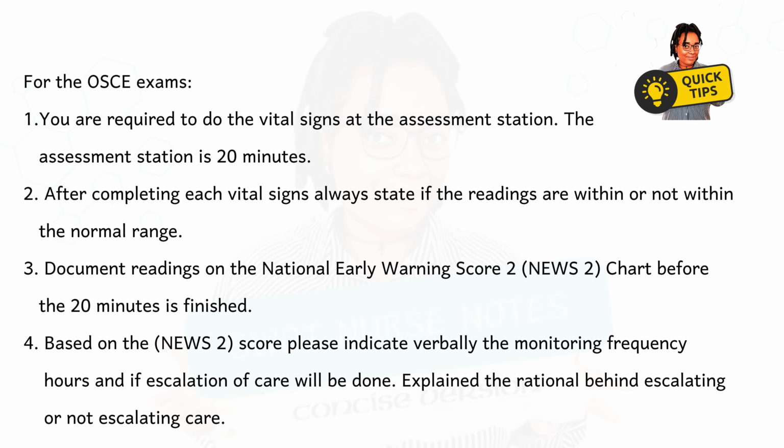For the OSCE exams, you are required to do the vital signs at the assessment station. Keep in mind that the assessment station is 20 minutes. After completing each vital sign, always state if the readings are within or not within the normal range. Document readings on the National Early Warning Score 2, NEWS 2, chart before the 20 minutes is finished. Based on the NEWS 2 score, please indicate verbally the monitoring frequency in hours and if escalation of care will be done. Explain the rationale behind escalating or not escalating care.